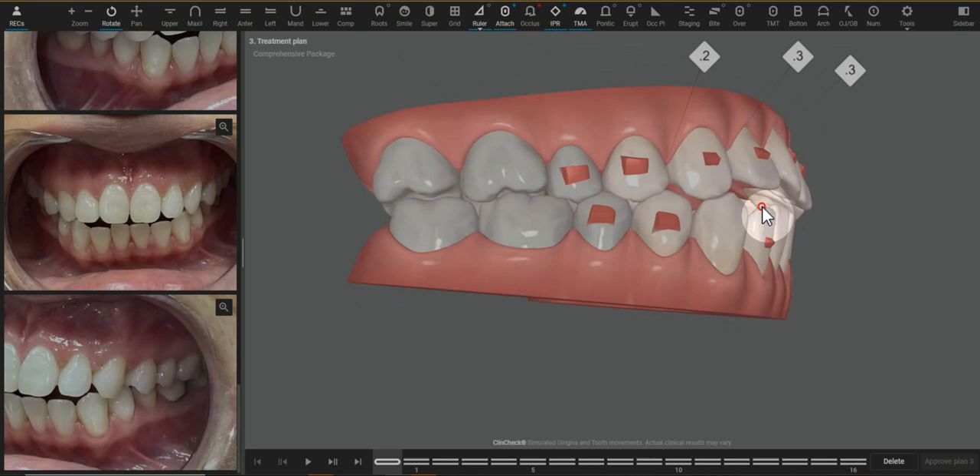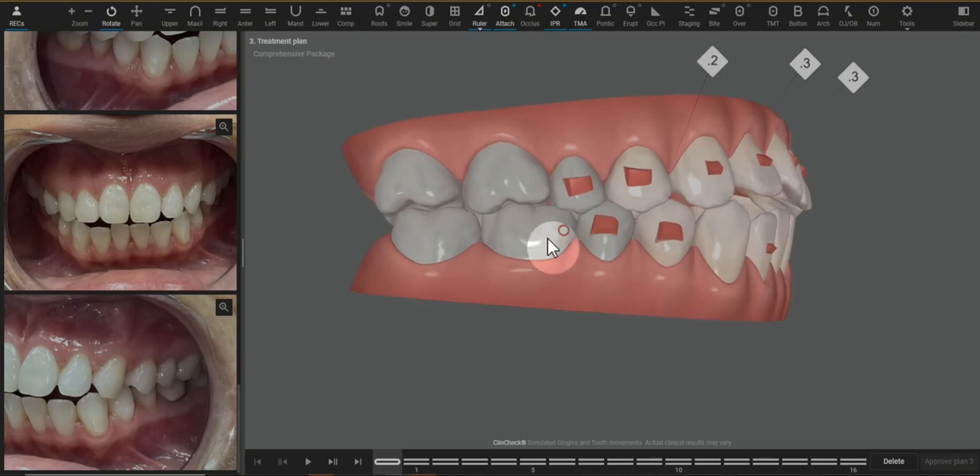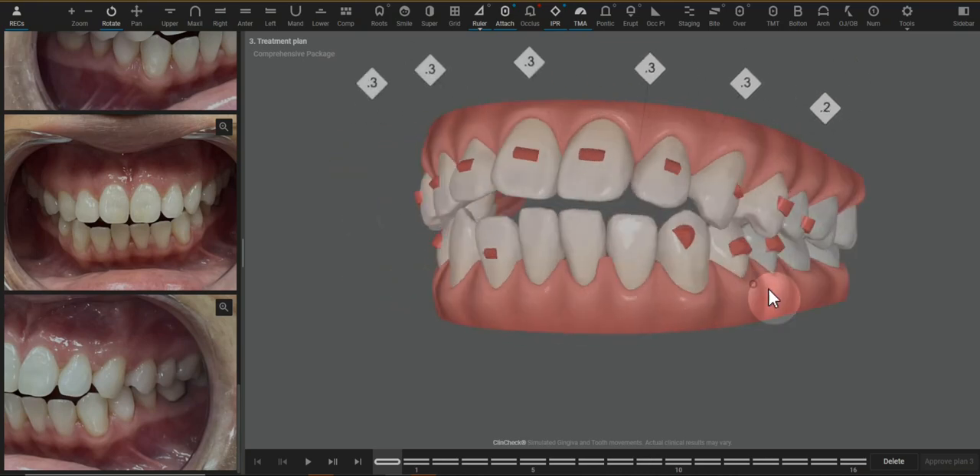And of course, no bite ramps because the patient wouldn't be able to bite on them anyway. Let me know if you have any questions.